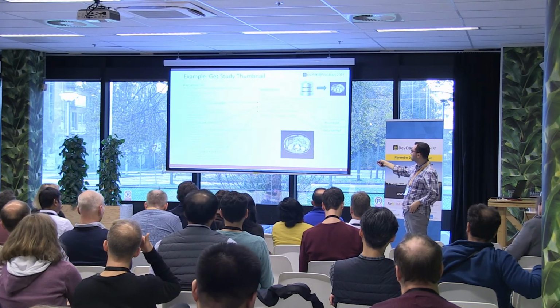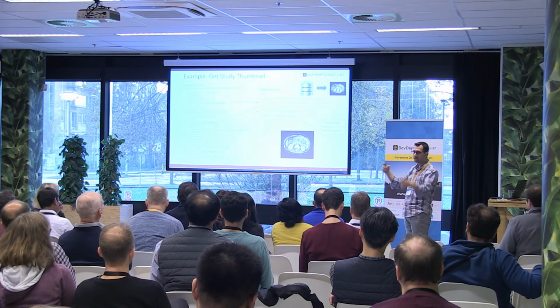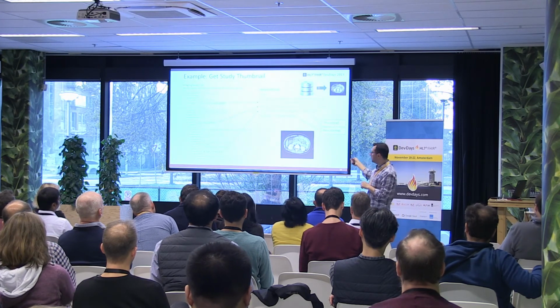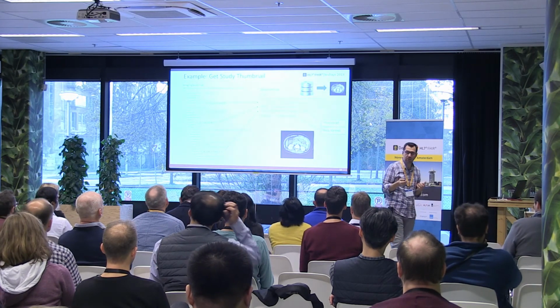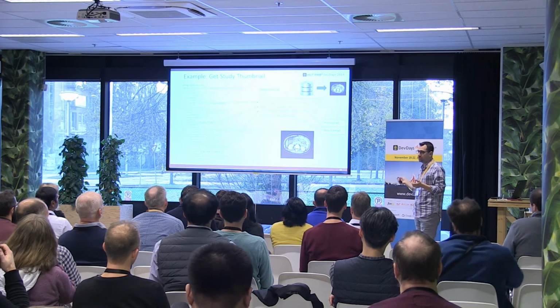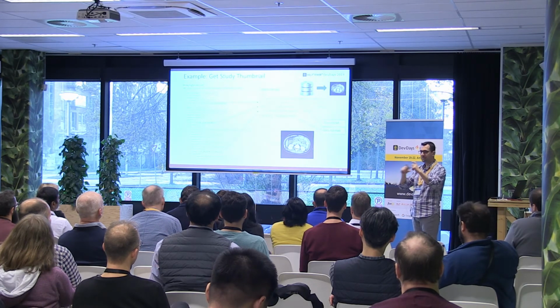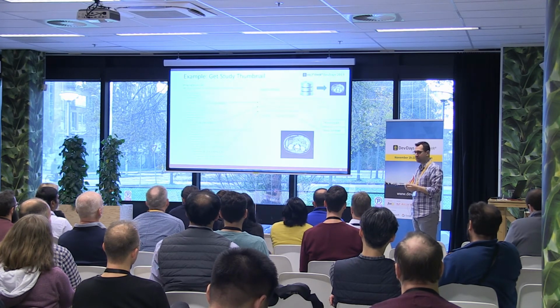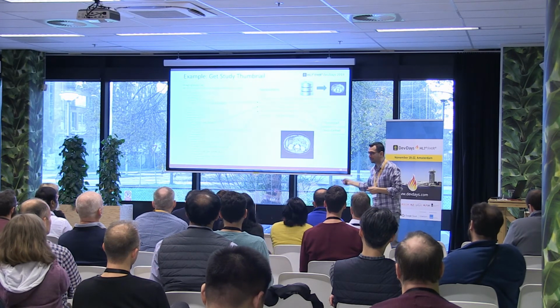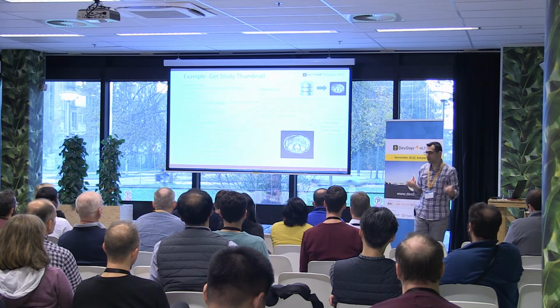The last part here is the size. So here you're saying 50 by 50 pixels. I want it scaled down to 50 by 50. This is super useful because, again, remember how we talked about these images being sometimes really huge? These images can sometimes be several megapixels huge. So obviously you don't want to retrieve the whole thing. You could just ask the server to resize it for you and then load whatever size you need. And then, of course, you could specify what format you'd like it in. So JPEG would be one, PNG would be the other, depending on your preference.